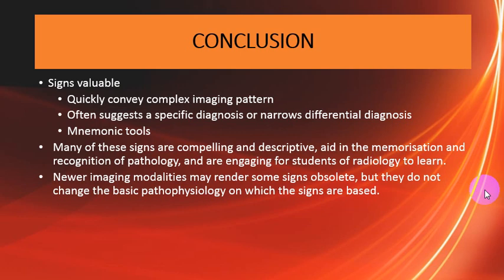And in conclusion, signs are valuable because they quickly convey complex imaging patterns and often suggest a specific diagnosis or narrow the differential diagnosis, and they serve as part of the mnemonic tools.